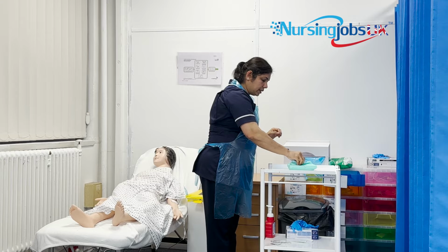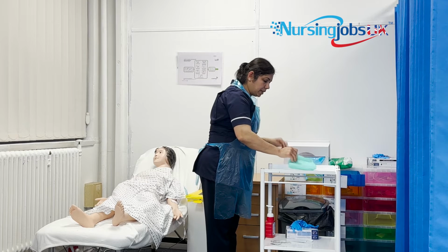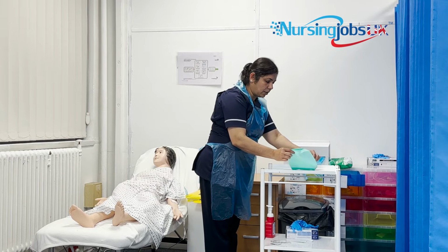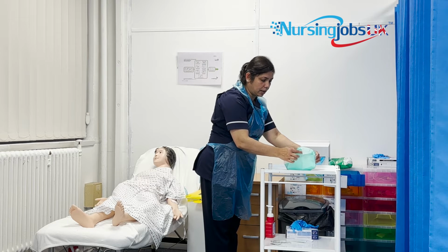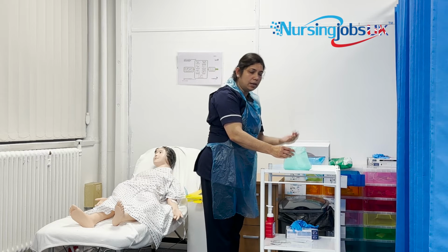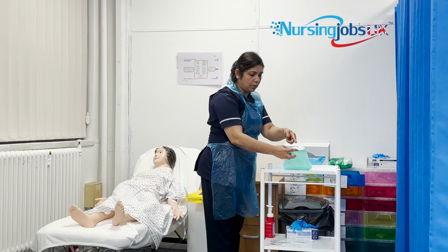So do not touch the inside of the dressing bag. So always make sure to pinch the dressing bags. So use both the hands, okay, and always make sure, like, if this one is the green one, you might be getting the blue one over there. So accordingly, you just need to think that the outer covering, always the inner covering will be the white part.